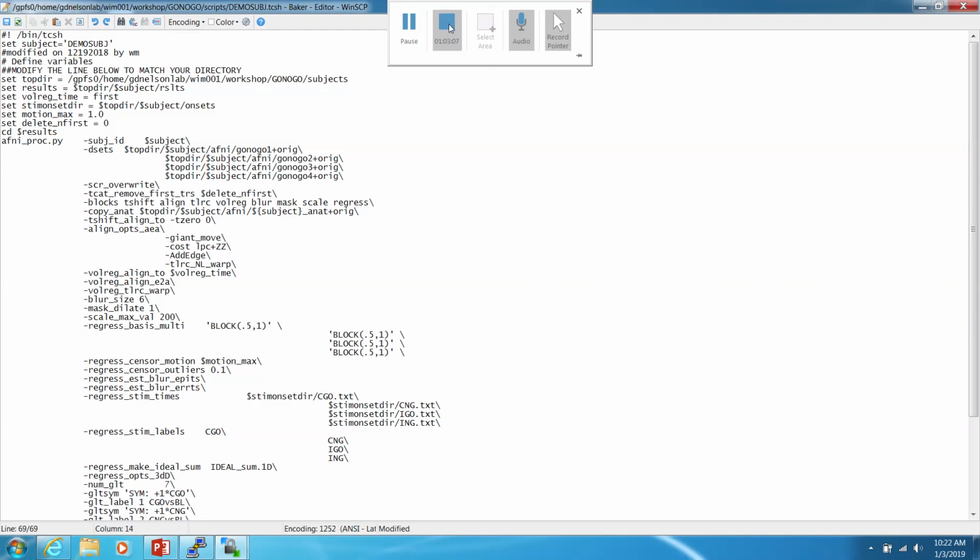Are there any last minute questions about any of the stuff that I talked about? Okay, cool. So we can talk about more organizational things, but that's AFNI proc.py.